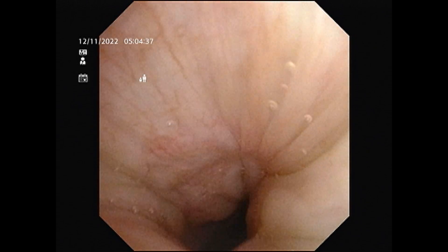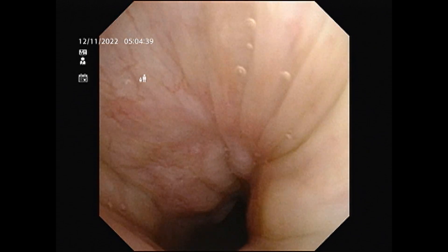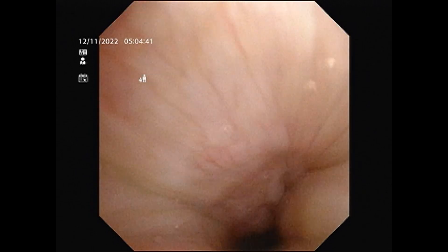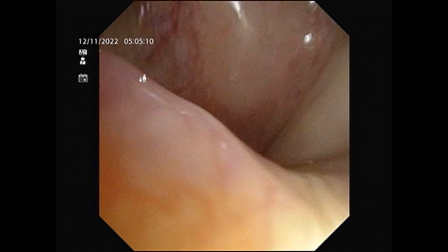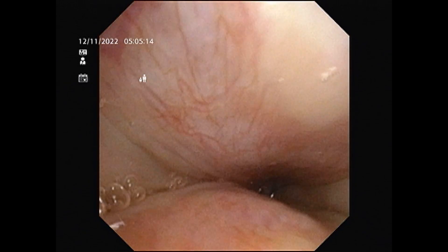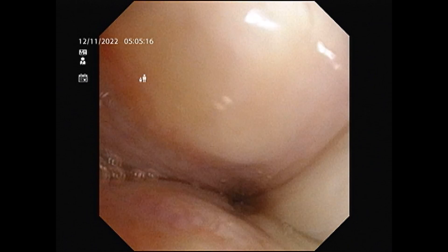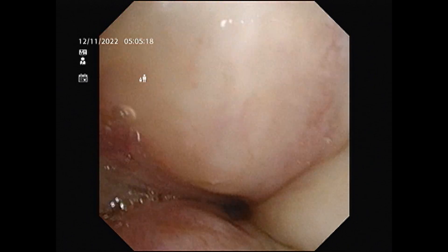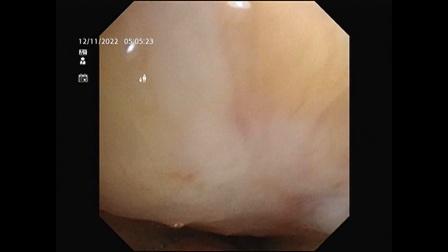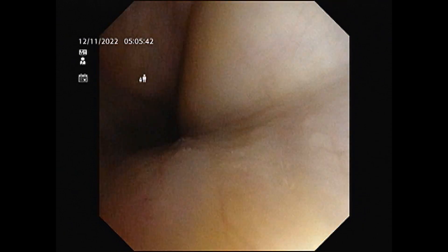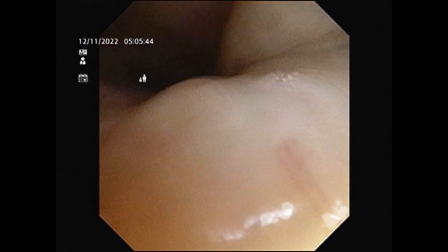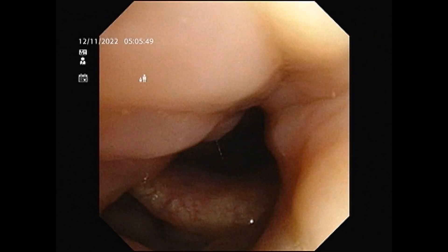You can actually see the vibrations inside. As the patient is trying to breathe, you can see a lot of vibrations as the soft tissue from all over is coming in contact with each other. As the anesthesia gets deeper and deeper, you can see almost the entire area is getting blocked off — the same area which was completely wide open when the patient was conscious, oriented and wide awake.